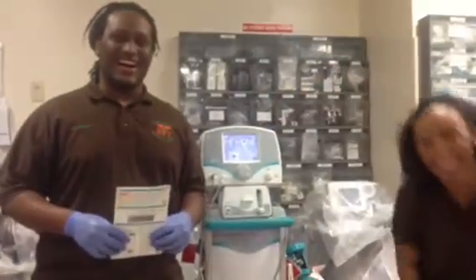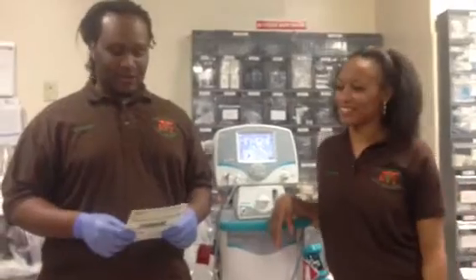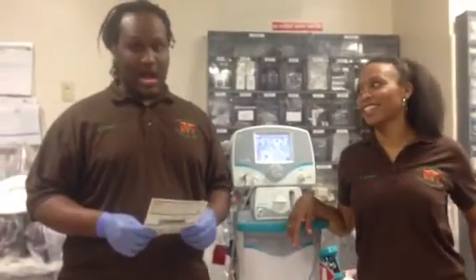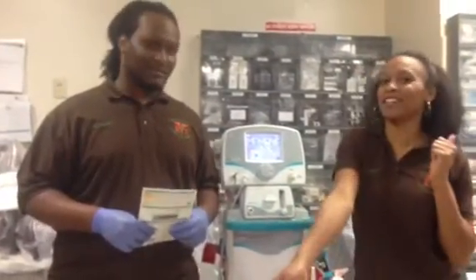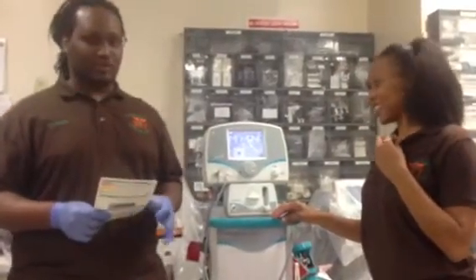Good afternoon, everyone. I'm Michael Johnson. I'm Alia Watson. And today we're going to be presenting the Icaria Inomax Nitric Oxide Inhalation Machine. First, we're going to start off by setting up some initial connections.